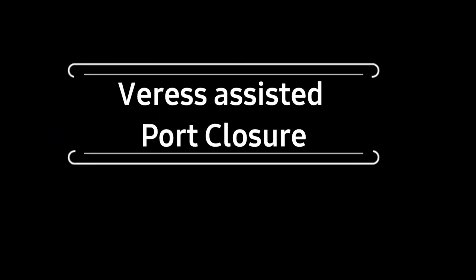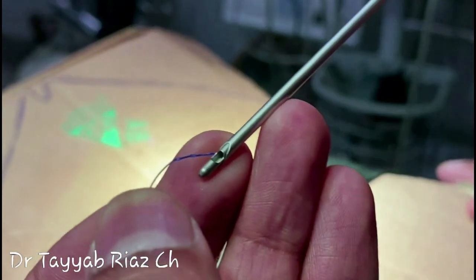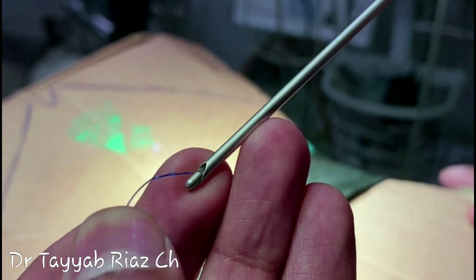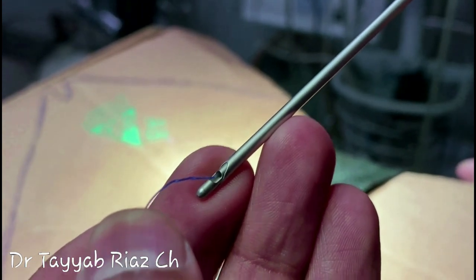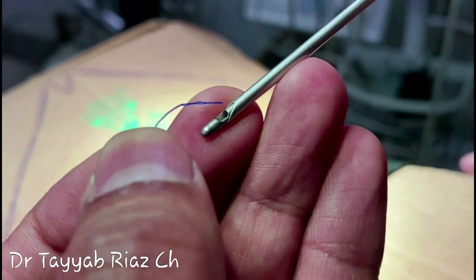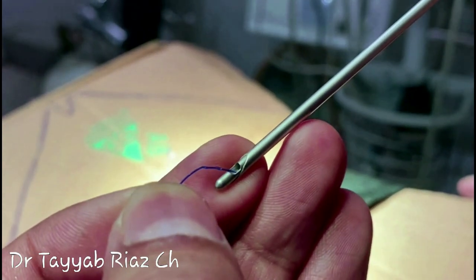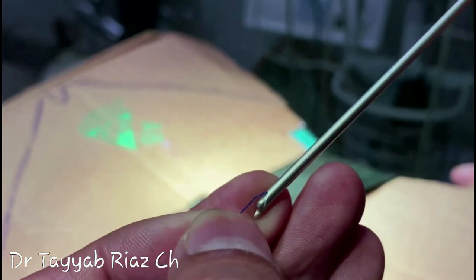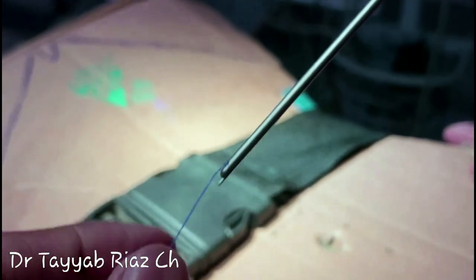There are many instruments available in the market for closure of port site defect, but today I will tell you how you can do it with this Veress needle that is already available in your tools. As you are seeing in this video, the only action needed is to pull and release the stylet of the needle with one hand, and meanwhile you can feed the end of the thread in the side eye of the needle and release it respectively with the help of the other hand, and you notice it is tightly gripped.